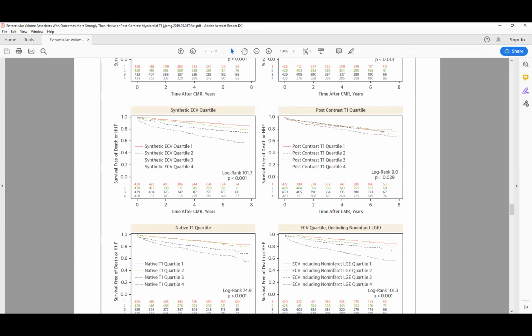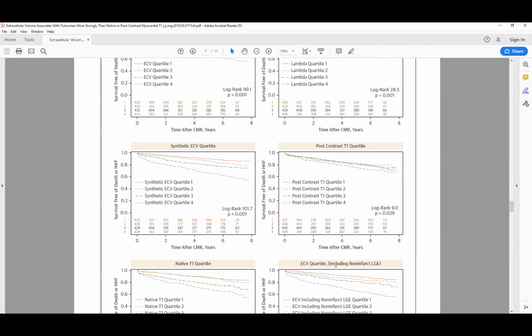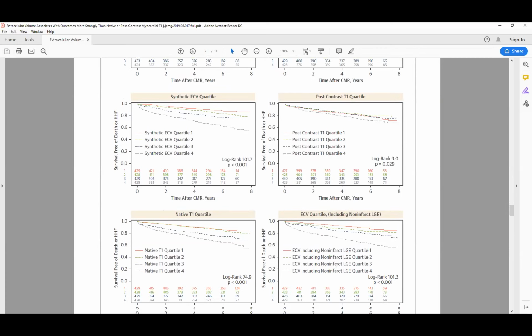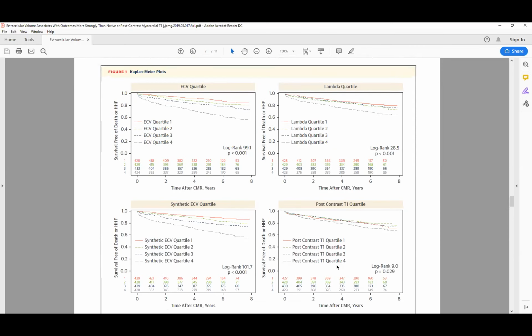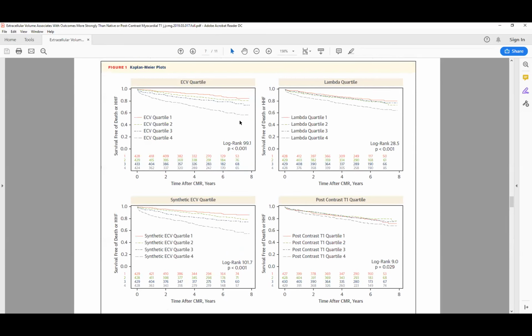there's no quantitative validation of focal non-ischemic scar being a robust quantitative measure of myocardial fibrosis. So my feeling is, why would we let an inferior measure bias downwards a better quantitative measure, regardless of which side of the fence one puts oneself. We looked at it both ways.